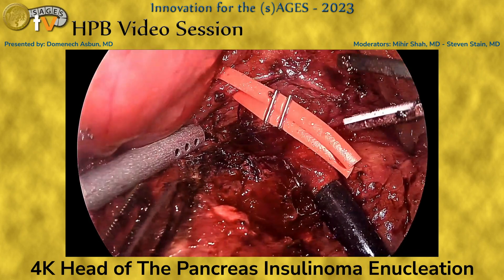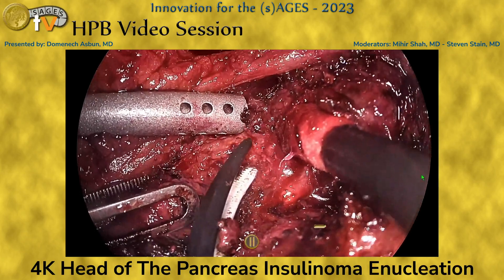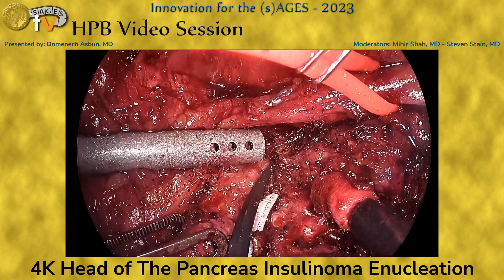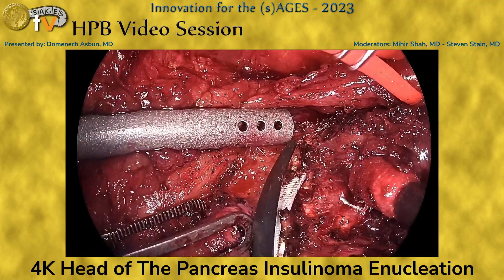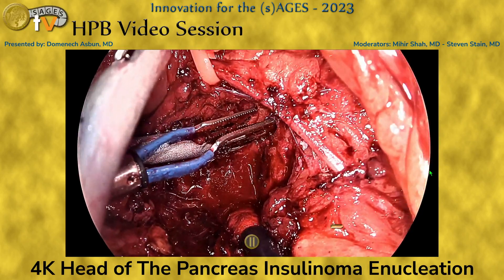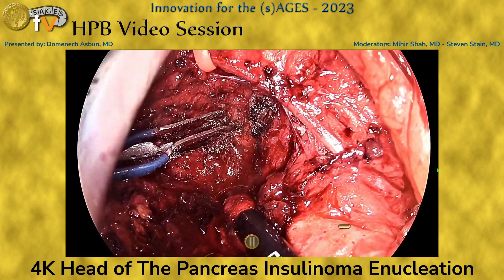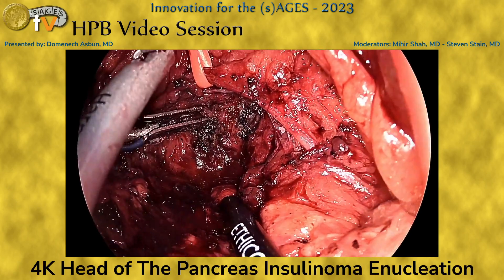As the dissection proceeds, we are a little more liberal with the use of cautery for hemostasis, as we now have a better idea of where our transection plane will be. Using small millimetric bites, we continue along that plane for the enucleation. Proper camera angle is also important, especially when we're this close — it's very easy to get disoriented during pancreatic operations, minimally invasive especially. We use a 45-degree scope, which gives extra flexibility in angling the camera.